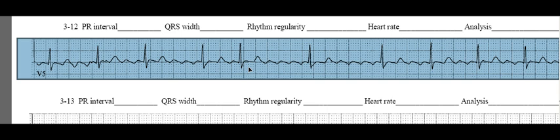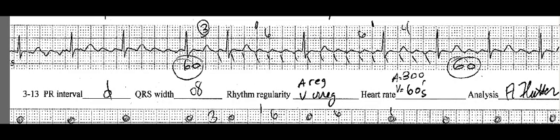When you mark them on your piece of paper, take your piece of paper and slide it over one flutter wave in one direction. You'll find your piece of paper is missing a line, so mark it on your piece of paper. You'll notice your sheet has a line that doesn't have a flutter wave on the machine — stick one there. Eventually your paper will have lines next to every single flutter wave, including one where the flutter wave is obscured by the QRS that you can't see it, but it's there because the flutter wave is continuous.